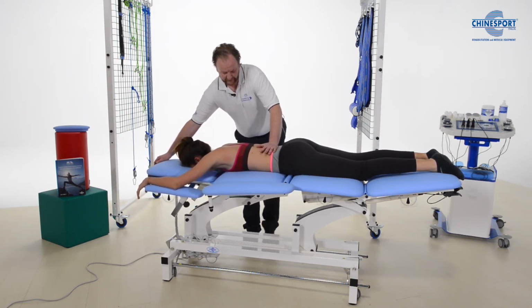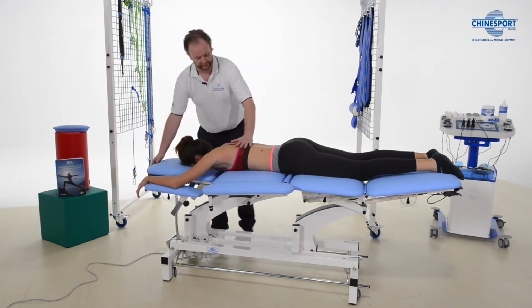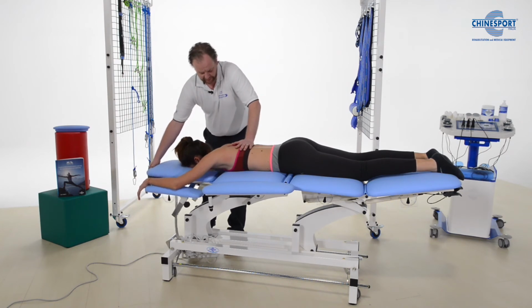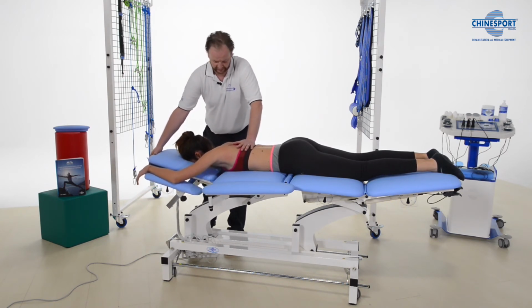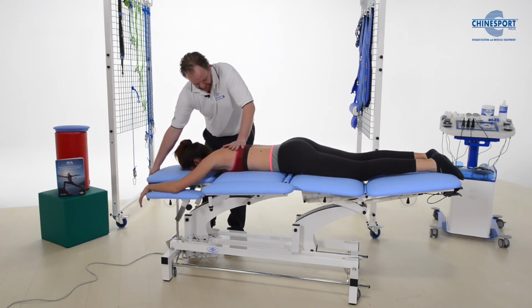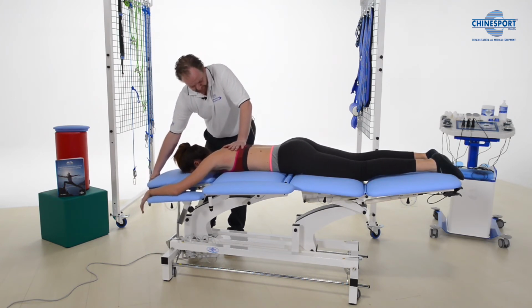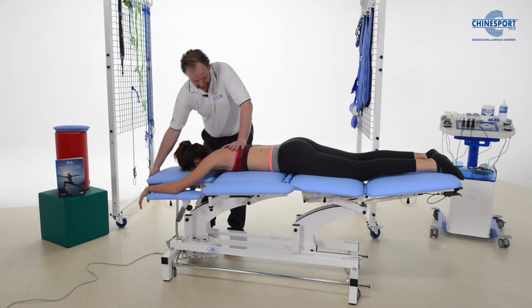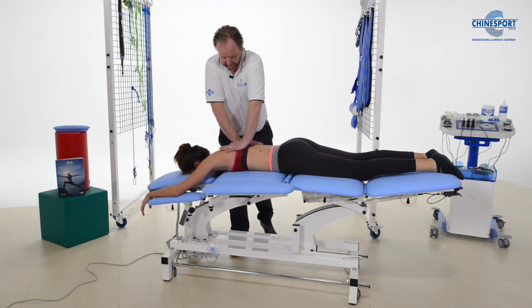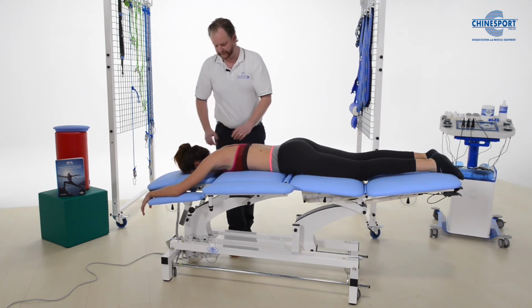We can also do the thoracic part. We're just using this part here. We're going up and down and blocking certain segments that need a bit more movement. Of course, then we can do our mobilizations, and we can provide an impulse.